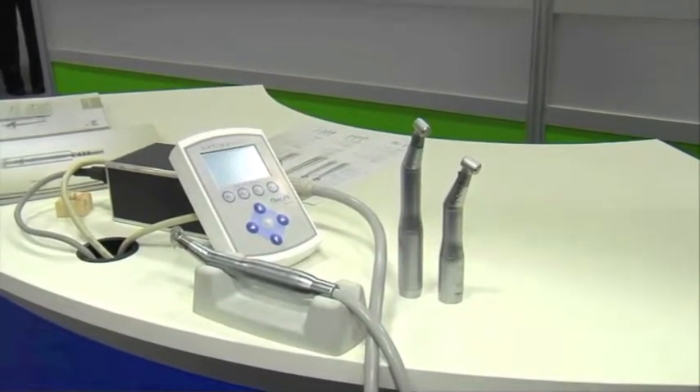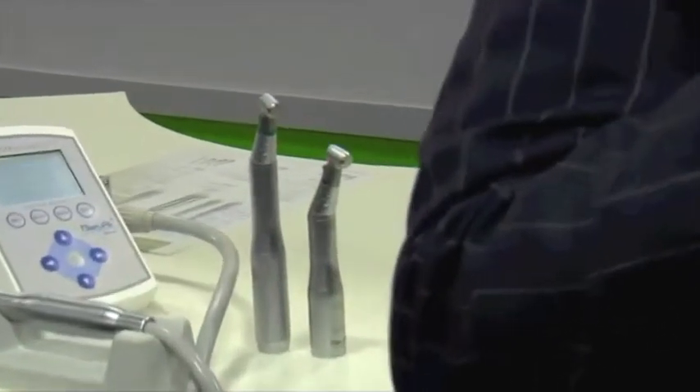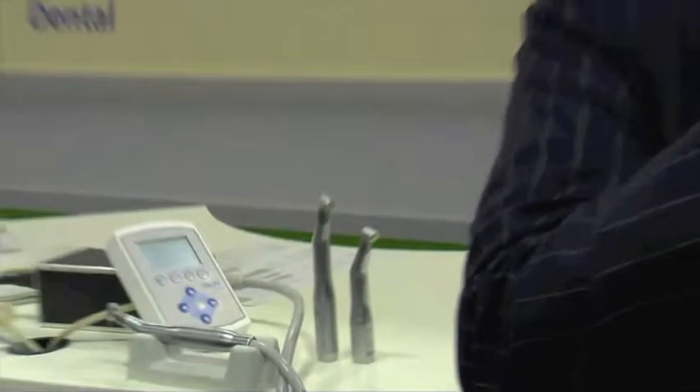As you can see, compared to our previous model, it's 40% shorter and lighter. One of the things the company has done is to have a philosophy of simplifying the dental practice by reducing clutter and incorporating additional functionalities within the same motor.